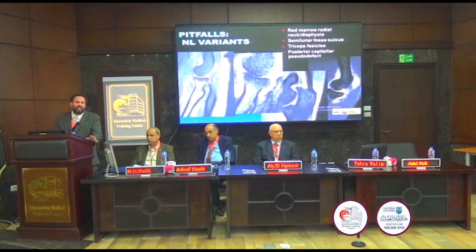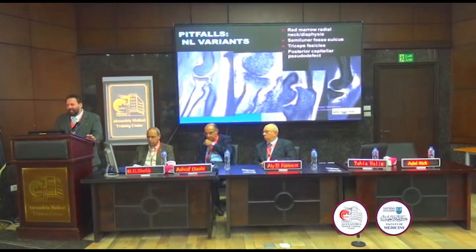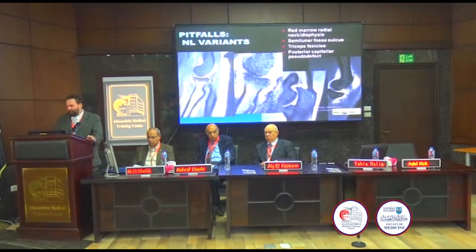And the way to distinguish that from pathology is, with one exception, which we'll end this talk with, all capitellar disorders are anterior, not posterior. So as a general rule, if you see something in the capitellum posteriorly, it's normal. And if you see something anteriorly, it's abnormal.